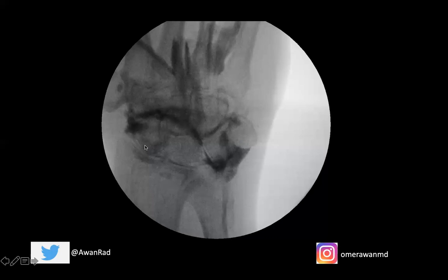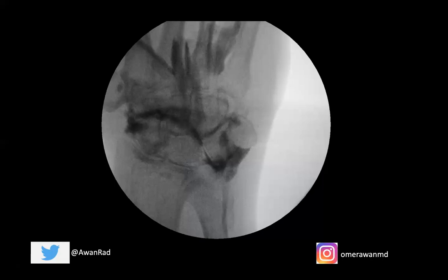We put our needle here along the scaphoid. We do a dorsal approach — not the palmar approach, but the dorsal approach. And once we're on the bone, we inject contrast, and contrast should be flowing in the radiocarpal joint right here. So we've done a fluoroscopic injection as part of a wrist arthrogram.